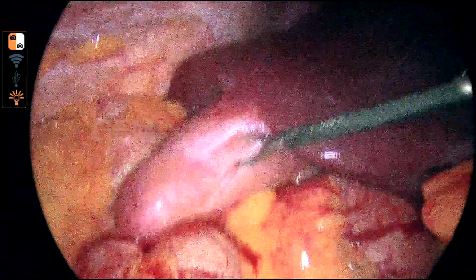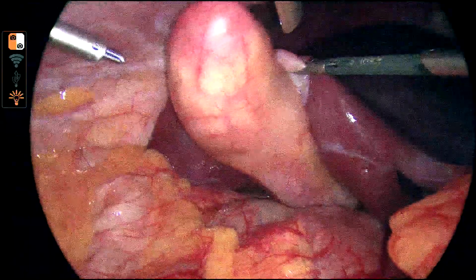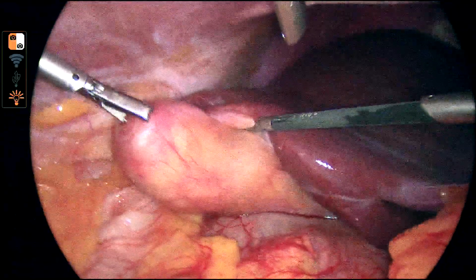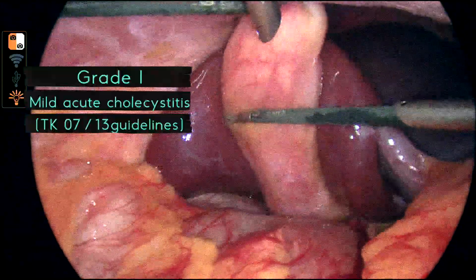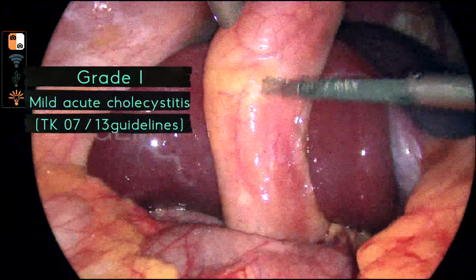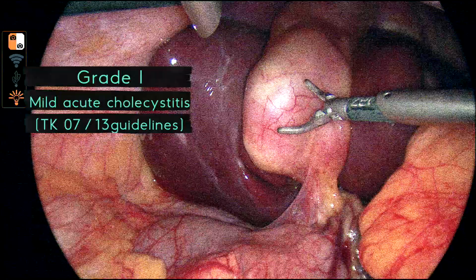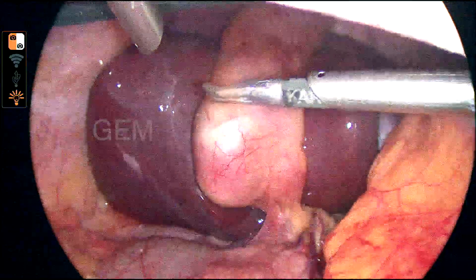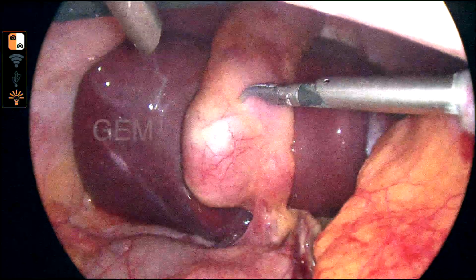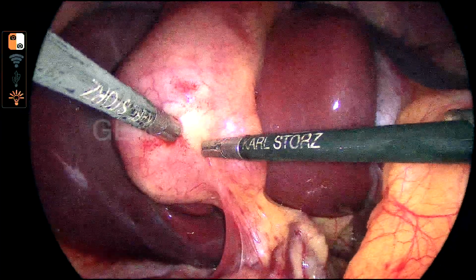I am just checking the gallbladder. You can see this is acute. In the 3 videos I showed a regular gallbladder, the same regular, small-size gallbladder. With cystic duct obstruction, it becomes edematous, large, distended, and becomes a thick-walled gallbladder. Since it is acute, this patient must be around 48 to 72 hours of acute cholecystitis.